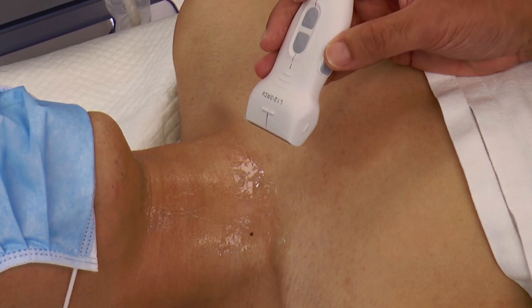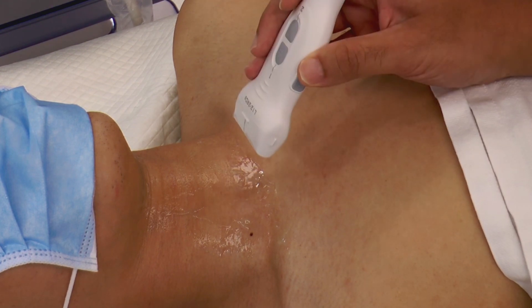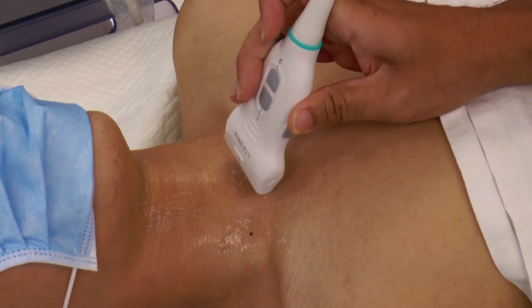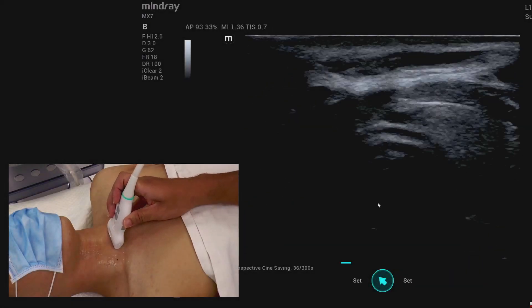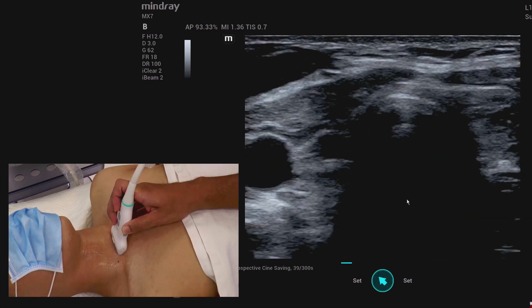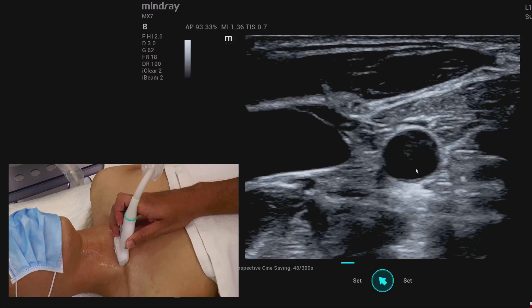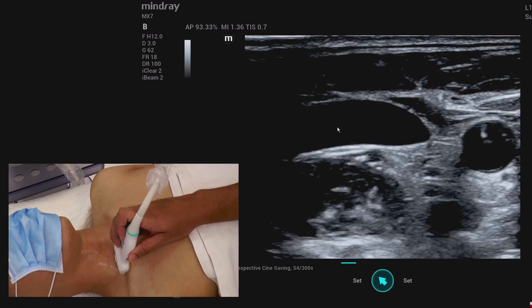We will now demonstrate the basic sonoanatomy of the airway using the linear probe, with the marker on the right side of the patient in the transverse view. I'm placing it right down on the suprasternal notch. We can see the carotid artery, which is pulsating. Moving a bit more lateral, we've got the IJ — the internal jugular.